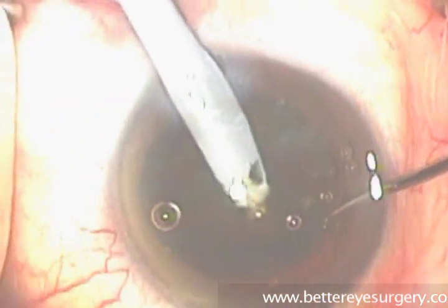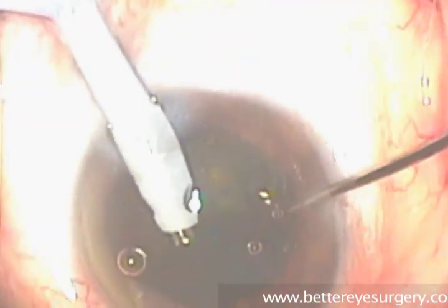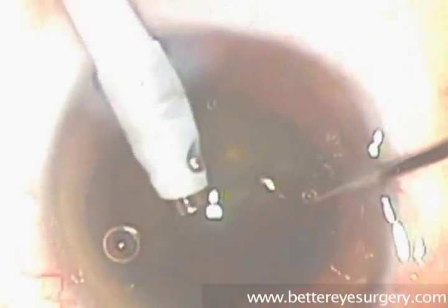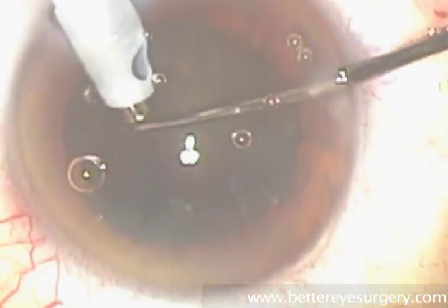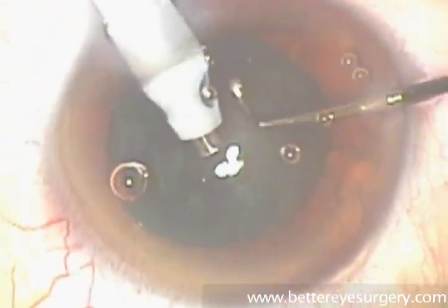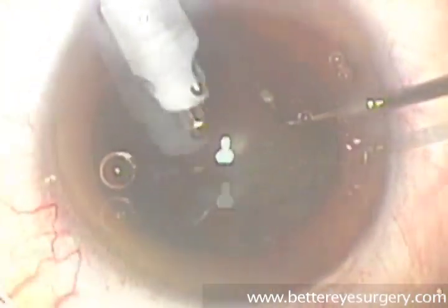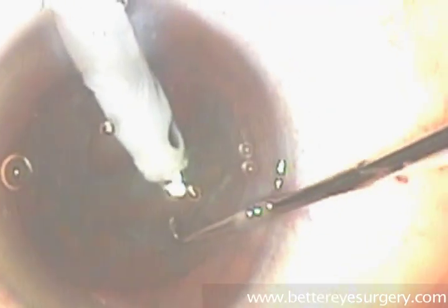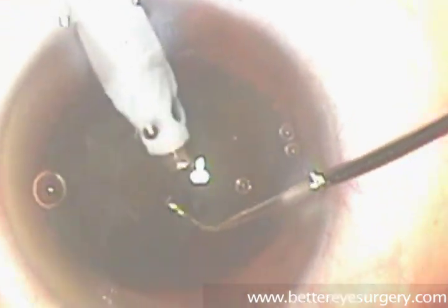The sleeve around it infuses balanced salt solution into the eye to allow the eye's shape to be maintained. The second instrument, which has a blunt ball tip and a slight bend to the end, allows the surgeon a second hand inside the eye to rotate tissues, to manipulate them, to break them up, and to feed them toward the needle, which is bit by bit removing the lens material from the eye.